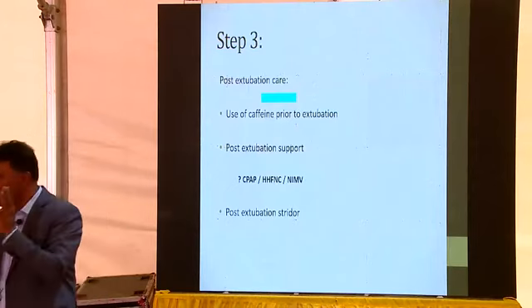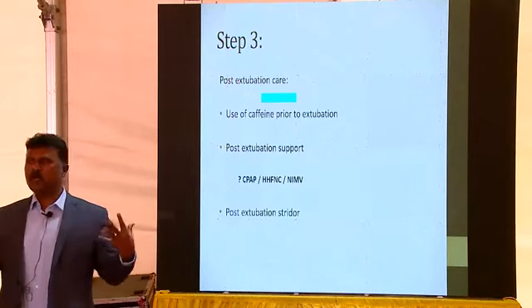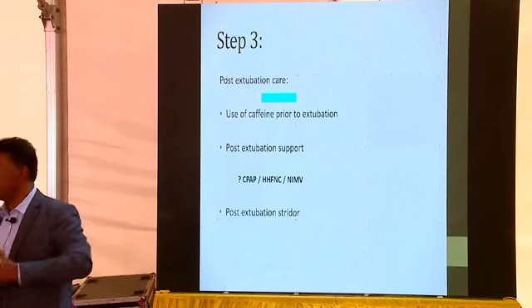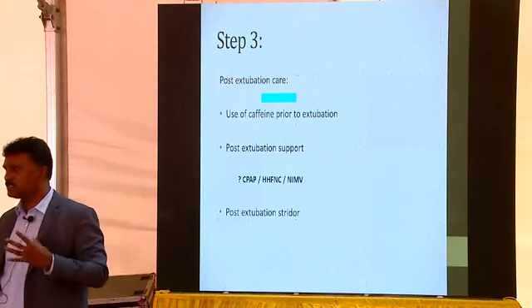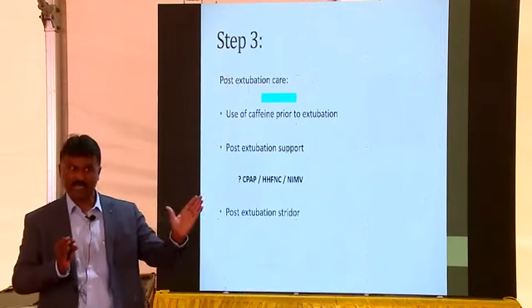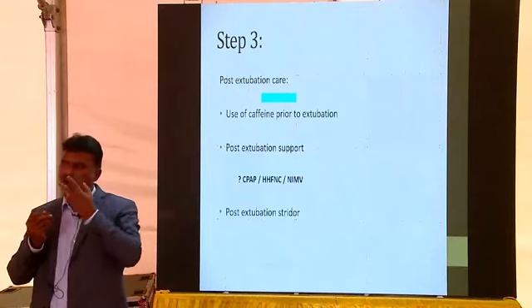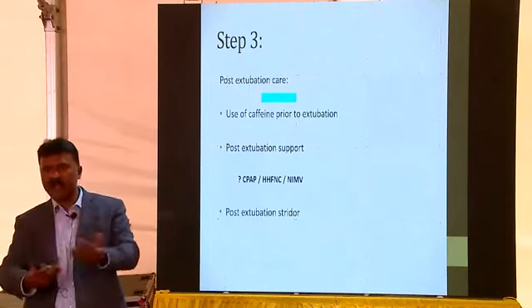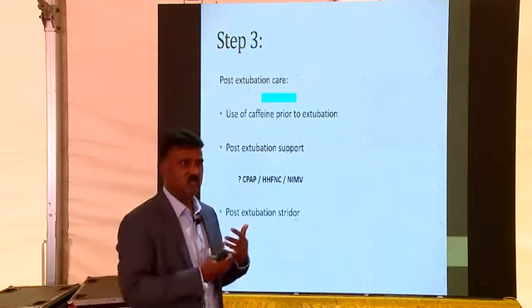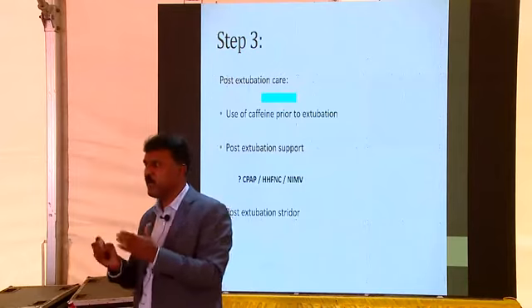CPAP is good physiologically because you are keeping the upper airway open, maintaining his FRC very well, with better diaphragmatic movements and some amount of oxygenation. Fantastic. But my nurses are not very happy. I can't do KMC. The mother has already waited 3-4 days for KMC. I want the baby in the next room, with good developmental care.